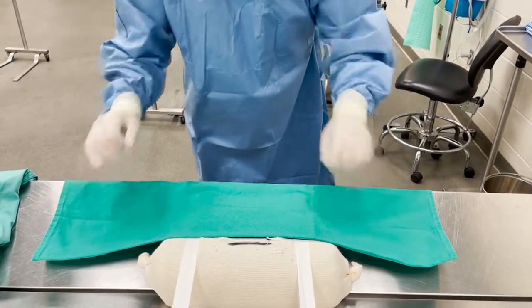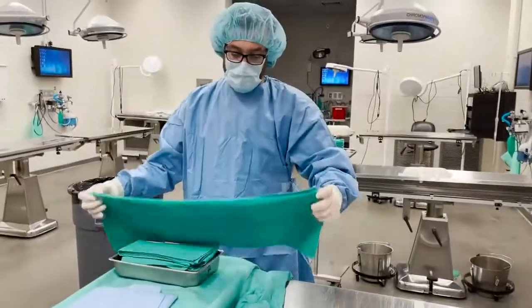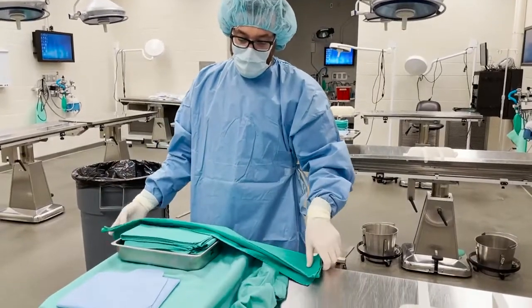Just flick those corners off. Now that you know that, watch your fingertips and constantly monitor yourself.